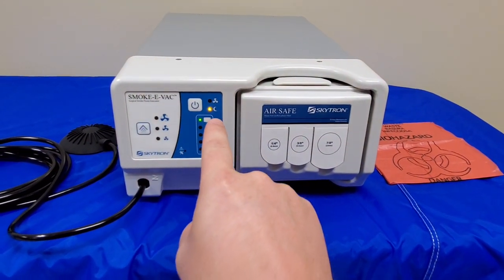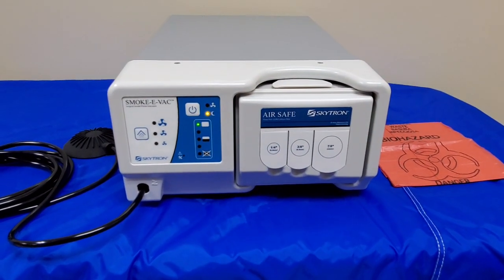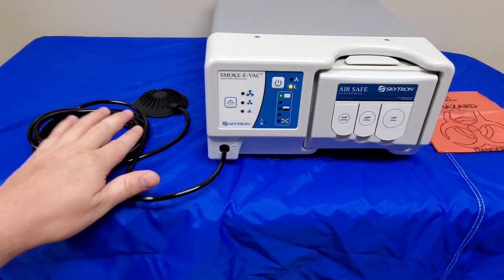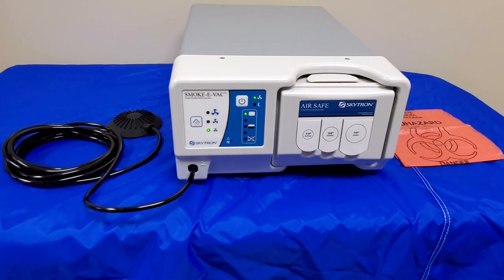You can see we are green — we're good to go. We are currently on standby. See the moon right here? The standby means that we are technically in foot pedal control mode. Press the foot pedal once and you can hear it turn on.